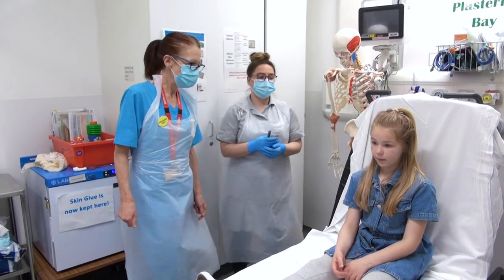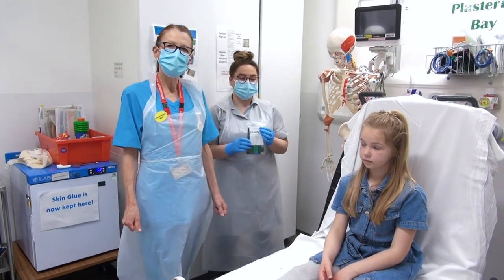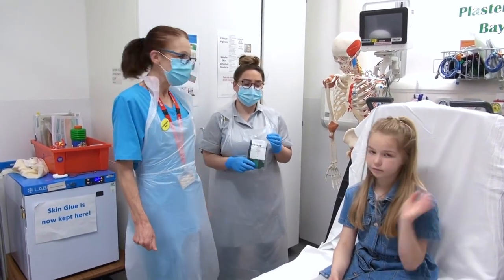We're going to show you how to put on a buckle splint now. These are commonly put on for a buckle fracture, and Lucy will demonstrate that for you now.